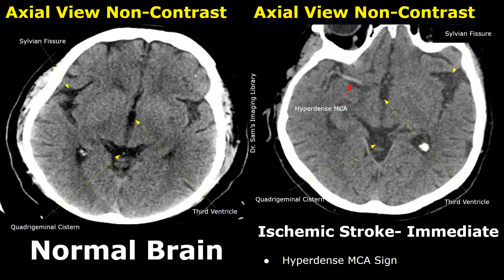This area is the sylvian fissure. This is the third ventricle. And over here is the quadrigeminal cistern.